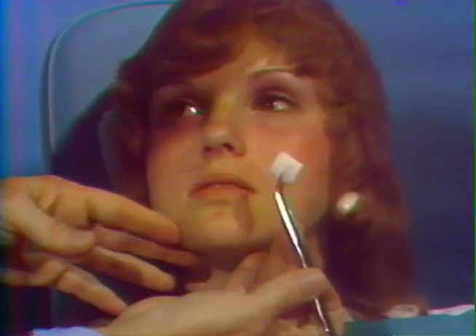I will now demonstrate the cotton roll placement for the middle superior dental nerve injection. Betty, turn your head a little bit towards me. Open your mouth. Keep your head towards me. Don't let me turn your head. This is now placed just forward to the zygomatic process of the maxilla. Now close your mouth. Fine. Now open once again.